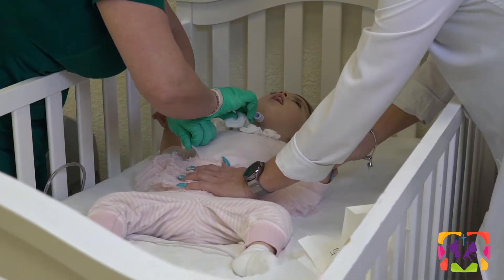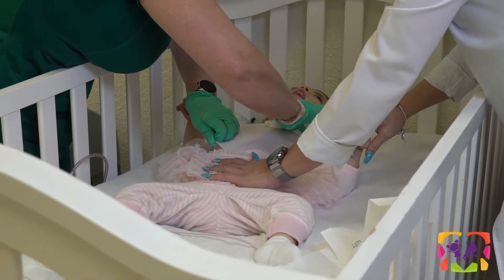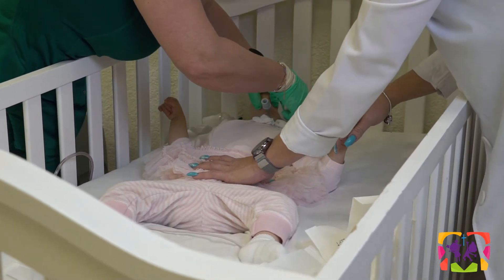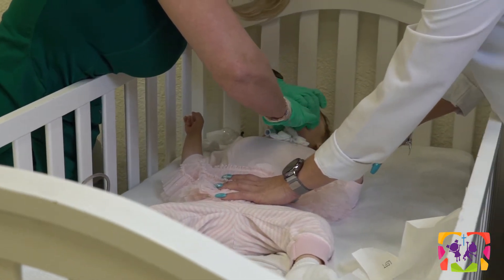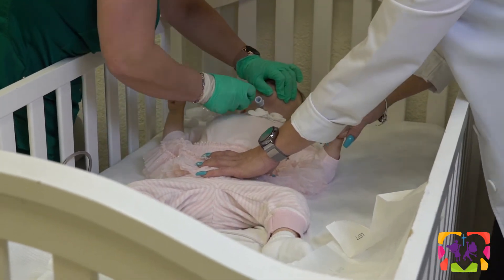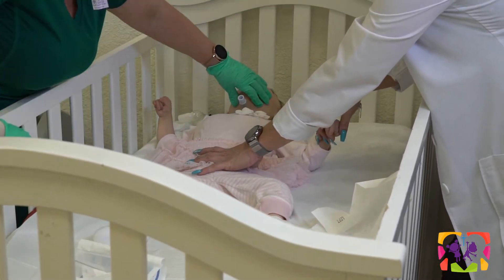Gently clean around the stoma. If you notice any redness or crusting, you can use some triple antibiotic ointment.